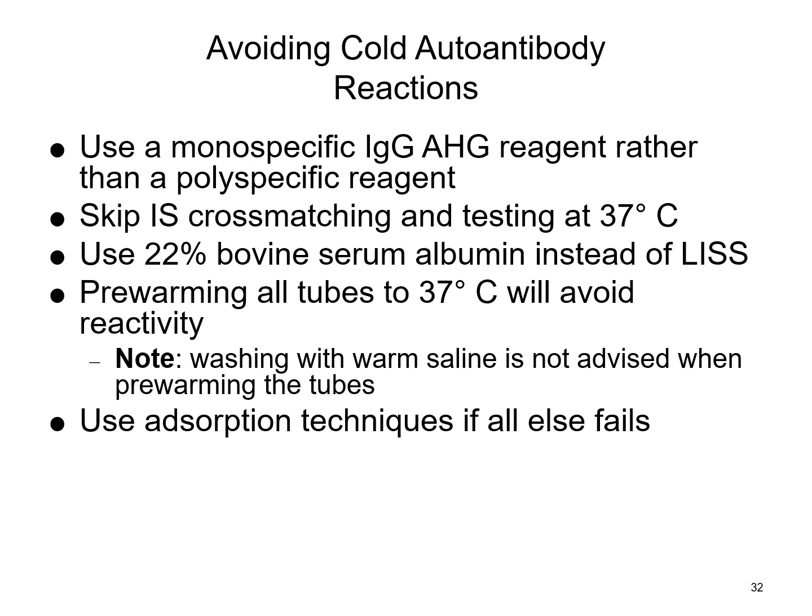When I've done pre-warmed crossmatches, if it is a really severe cold autoantibody, and I'm talking about one of those that is affecting the results throughout the entire lab, over in hematology they're actually having to stick the patient, put a heel warmer on that tube, literally run it to the lab, and the machine is primed, ready to go, and you are literally inverting that tube as you're running to the lab, and you're doing manual testing on that machine to run it through, because as soon as the cold hits it, it starts agglutinating.